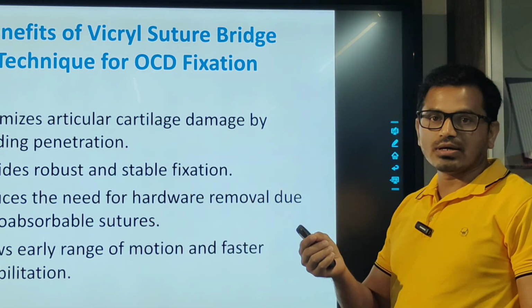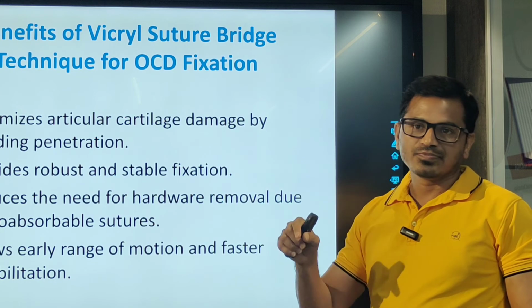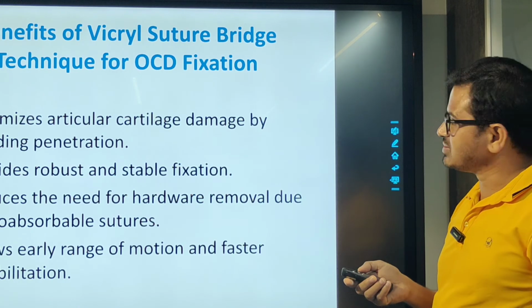In case we use implants like screws, pins, then we have to remove them later. So that will be another surgery for the same thing. It also allows early range of motion and faster rehabilitation.